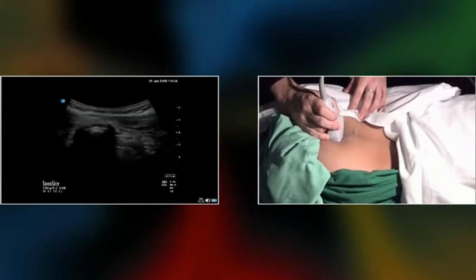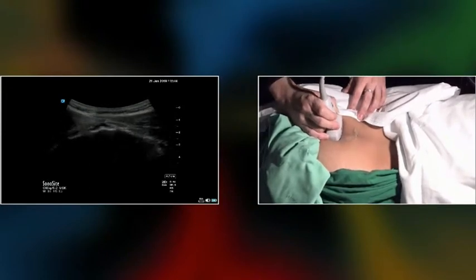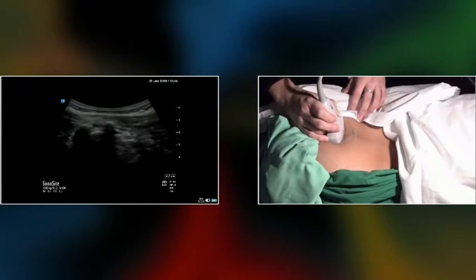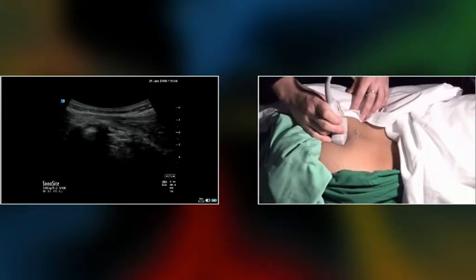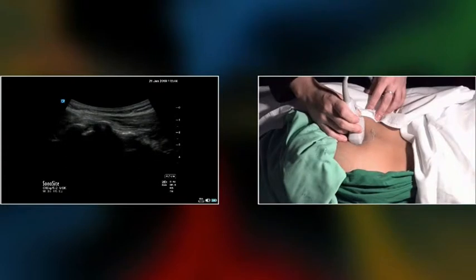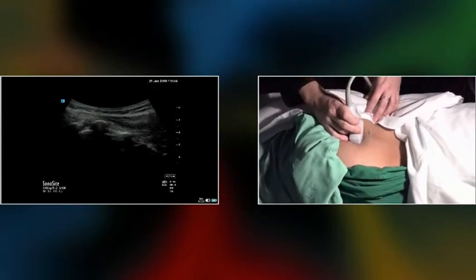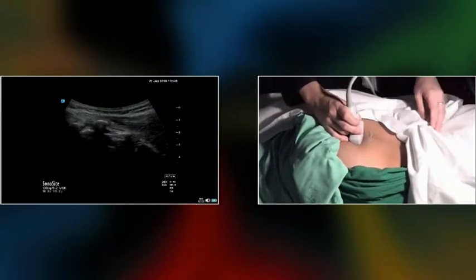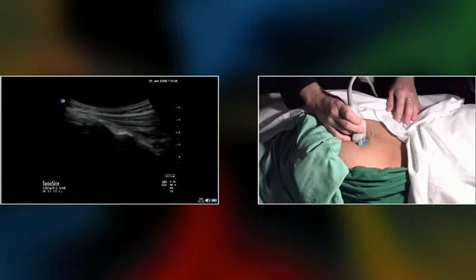If I want to do the sacroiliac joint injection on the right side, I just try to focus on the lateral border of the sacrum, which is probably this one, and just scan up until it hits another bone here. So you can see this gap. I just guess that this is probably the sacroiliac joint, but I'm not 100% sure, because the way to confirm that, you should see the structures that I mentioned: medial sacral crest, sacral foramen, lateral sacral crest, and then sacroiliac joint. So just move upward until you see that relationship.